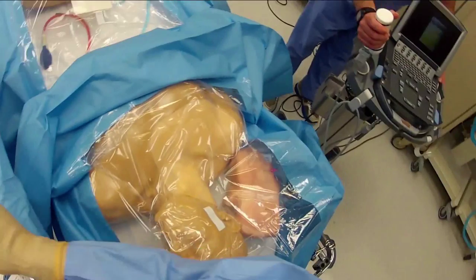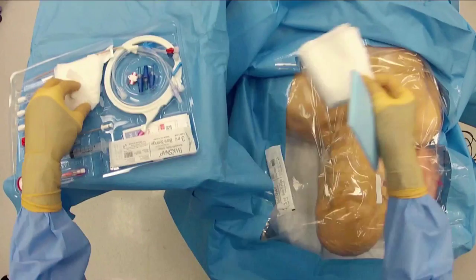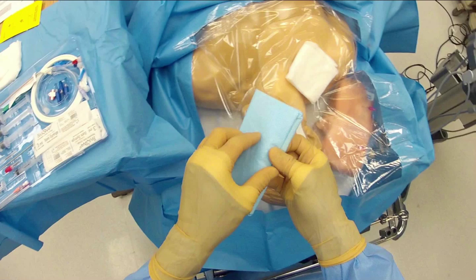We're going to get rid of all the paper and get it out of the way, remove some of the inserts and the informational packaging. We'll make sure the 4x4s are where we want them, and then we have the sterile sheet that we've opened into our field.